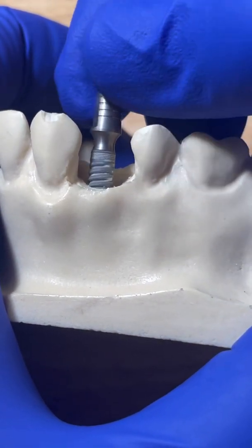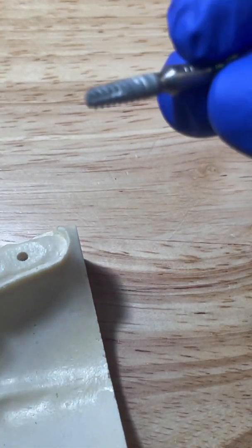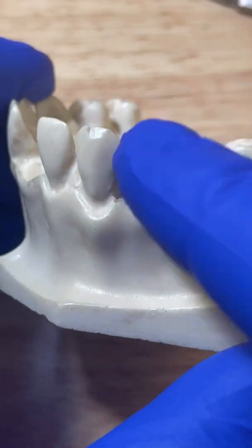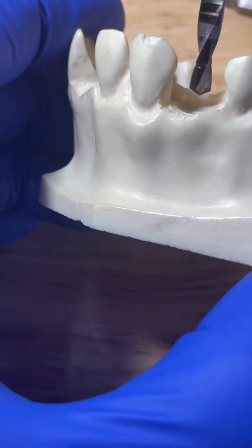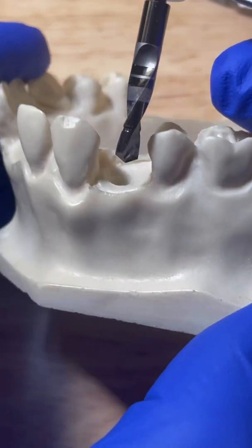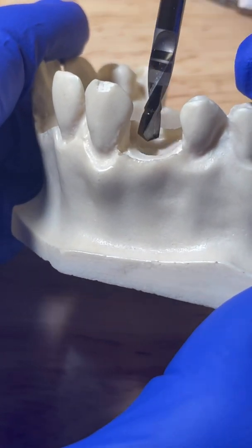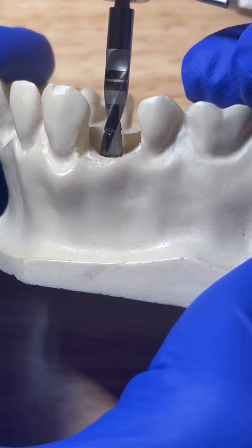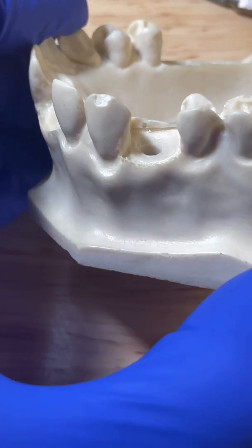We're going to back it out and use the next size drill. Right now this implant is still usable, so we can take it out and put it into a little sterile compartment in your surgical kit — like a little metal bin. Just drop it in there. Don't put it on the table. Then just use the next size drill to pass it through there. If it's only tight because of the bone perimeter, you can go in just a little bit. Or if there's resistance down towards the apex, you can use the next size drill up and go all the way to depth, then go back and place your implant.